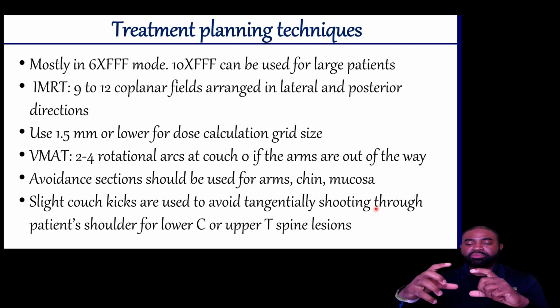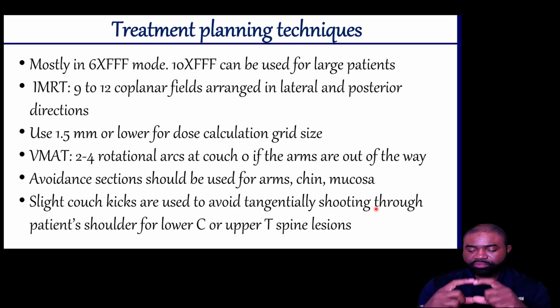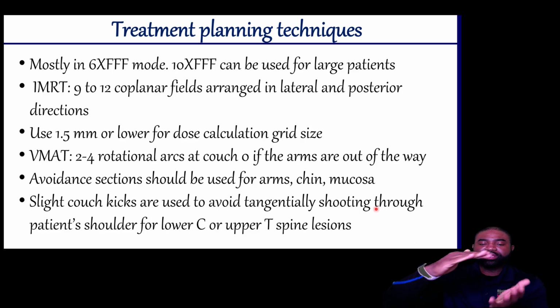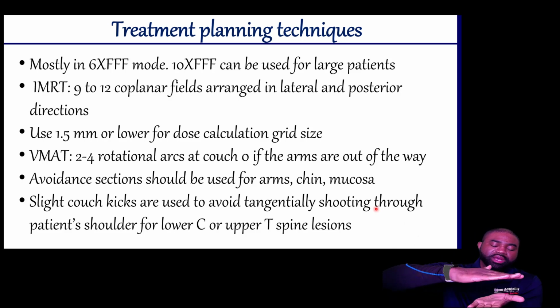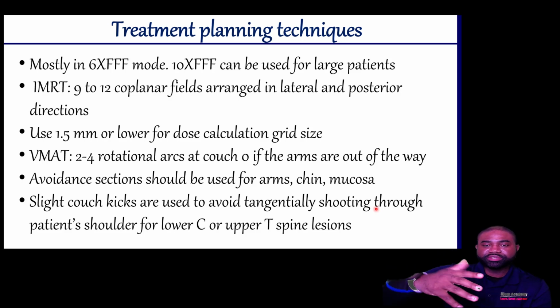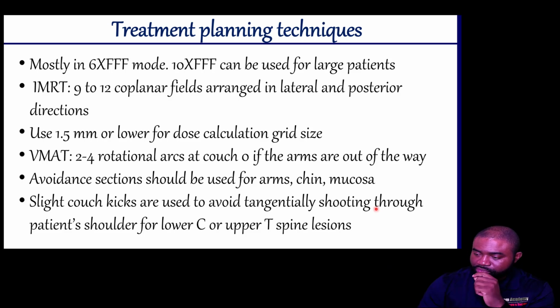because most often the vertebra is some sort of this shape, and so when we rotate our collimators at 90, it will actually limit the exposure of the spinal cord to spilled radiation, or to spilled dose. And that often works pretty great.